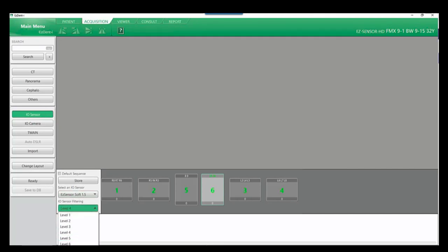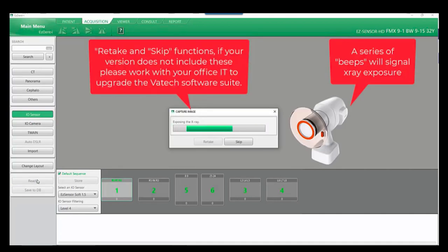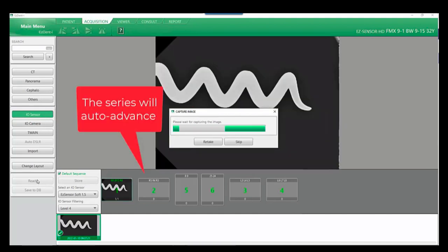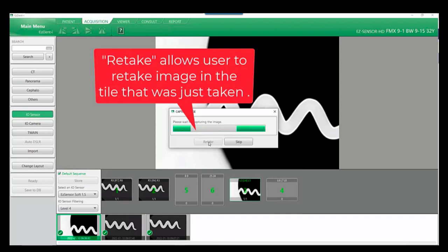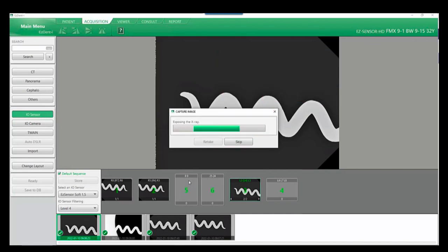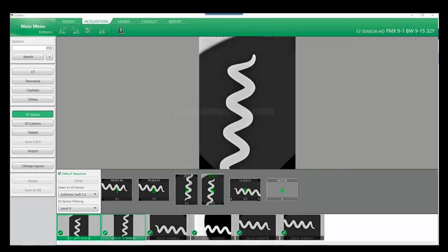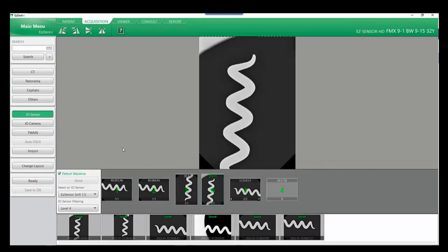You're now able to plug in the IO sensor — noting the sensor has been recognized, you do have a filtering option of one through seven. Here we have selected the default sequence, followed by ready, where we are ready to capture our image. The skip feature allows us to skip over individual or multiple tiles. Once the series is completed, all images will be automatically saved, noted by the saved icon on top of each image. If you do not see this, go to main menu, acquisition, and ensure auto DB save has been selected for future images.